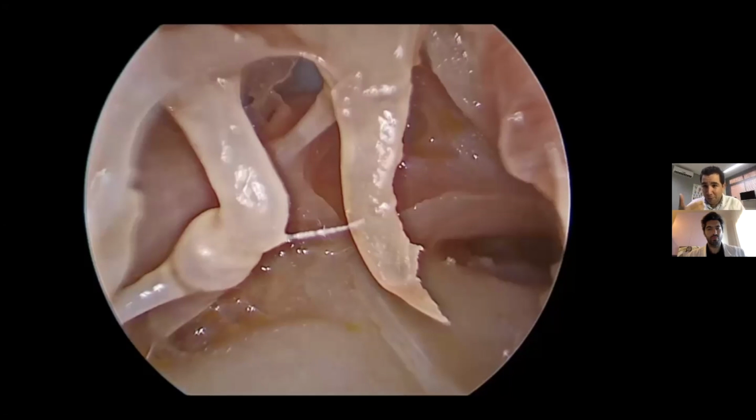And for me, since I also do sinus surgery, this is kind of the osteomeatal complex of the middle ear. If you think of the middle ear and mastoid system as the fifth paranasal sinus, this would be the ostium or the osteomeatal complex. So if you have problems there, sometimes you need to open and create ventilation routes between the middle ear and the mastoid. Of course, this is not going to solve 100% of the disease, because some diseases are not related to selective dysventilation syndrome or blockages, but some others are. And it's important for us to look for the problem.